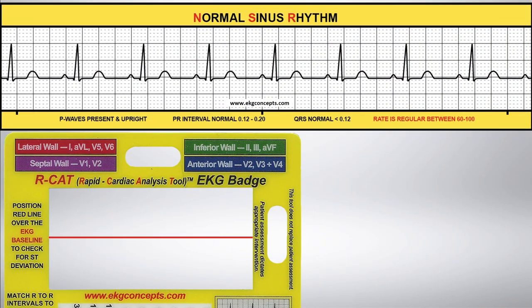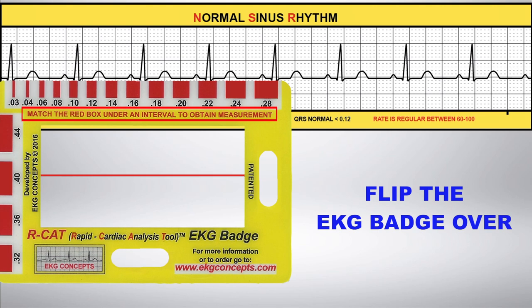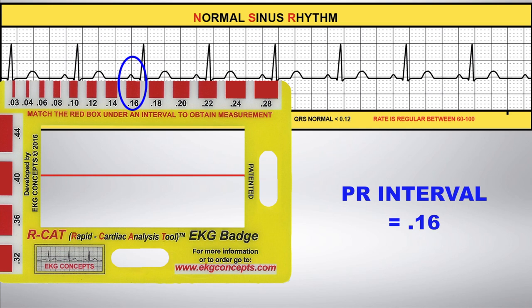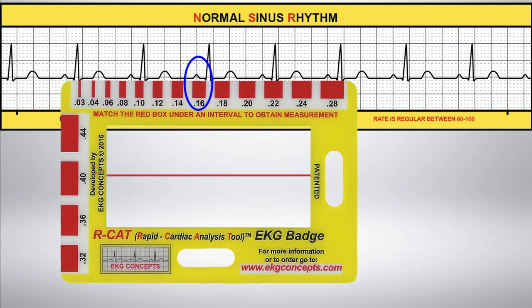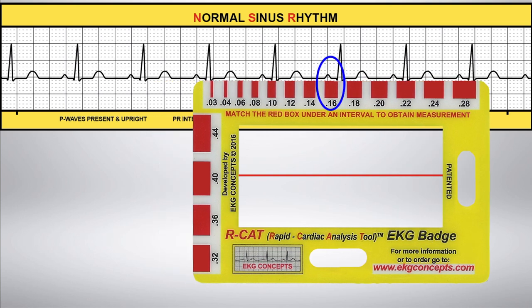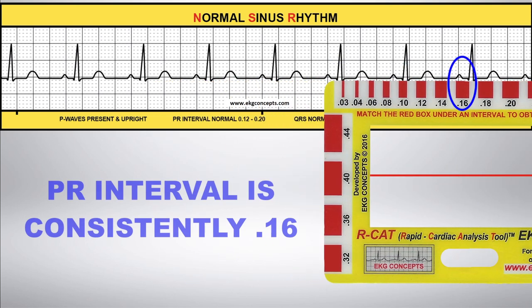Notice that all the P waves are present and upright. Now flip the badge over and align the calibrated red boxes under the cardiac intervals starting with the PR interval. Slide the badge along the rhythm strip to make your measurements. The PR is consistently 0.16 and within the normal range of 0.12 to 0.20.